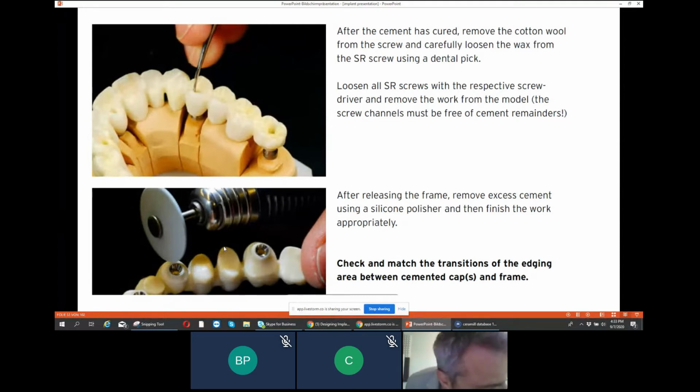You will ask me, how will the dentist do the try-in when we are not cementing the bridge? We have to wait till the end to cement the bridge, but how will the dentist do all the try-in? For the try-in, you can use a provisional cement, not for all the implants if you want, but not the final cementation. The final cementation will be done at the end.